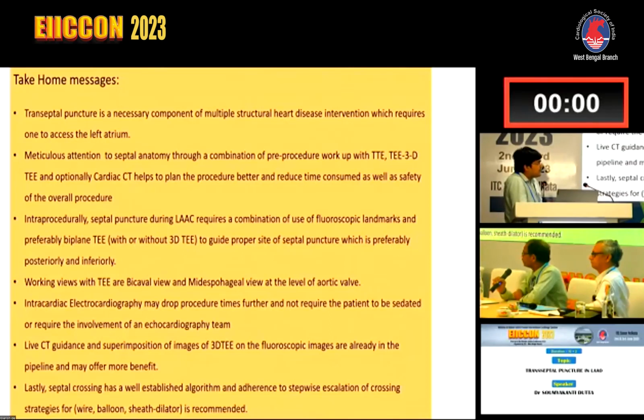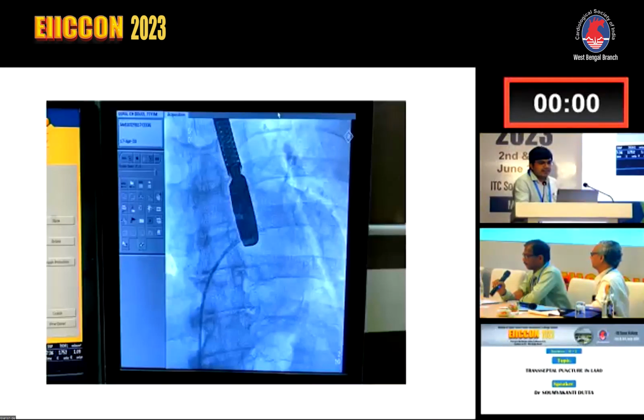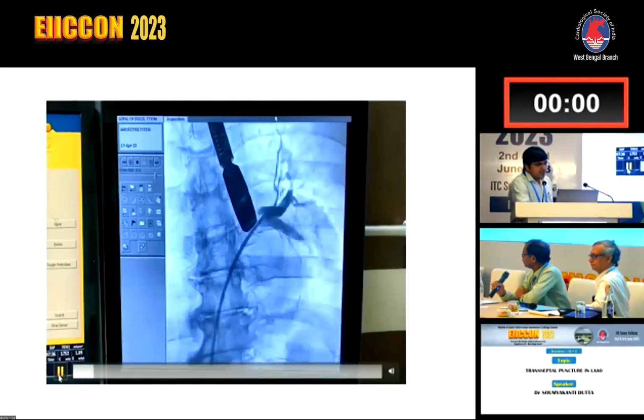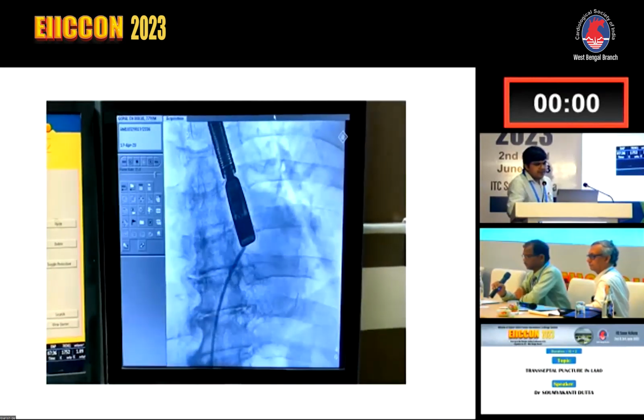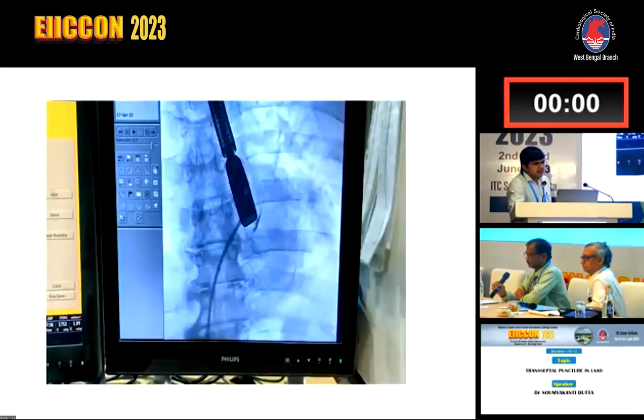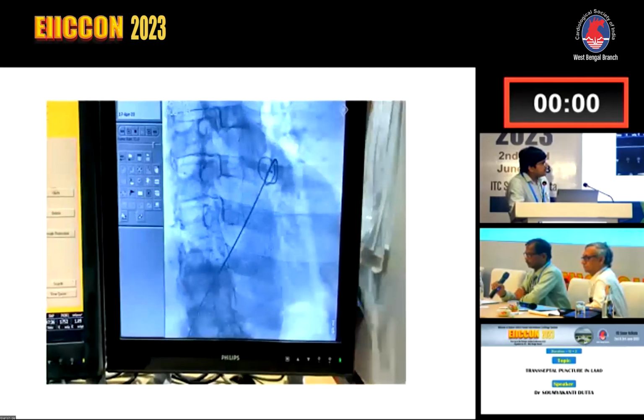If I feel difficulty in approaching the left atrial appendage, then I inject some kind of dye. I have put a video also, sir. So generally after puncture, the needle straight away goes to the left upper pulmonary vein. It has to be dropped down again, and you can see the left atrial appendage. Then the wiring is done, and you can slowly release the device.